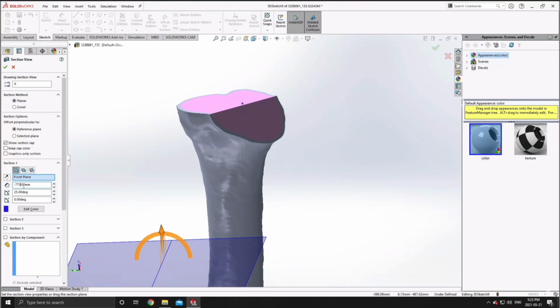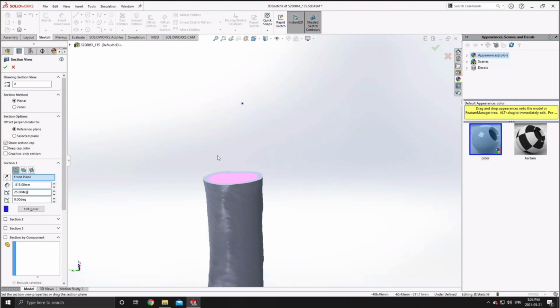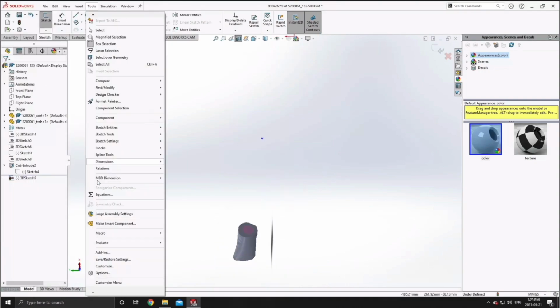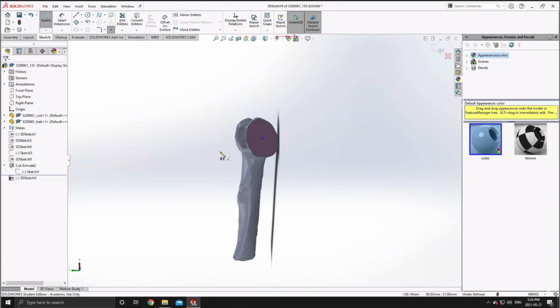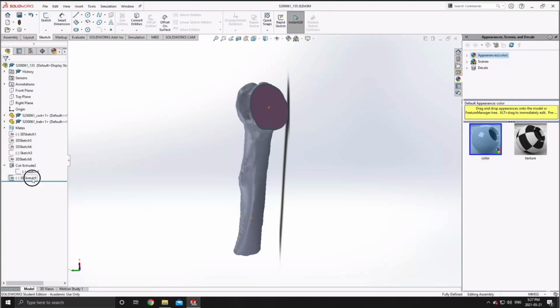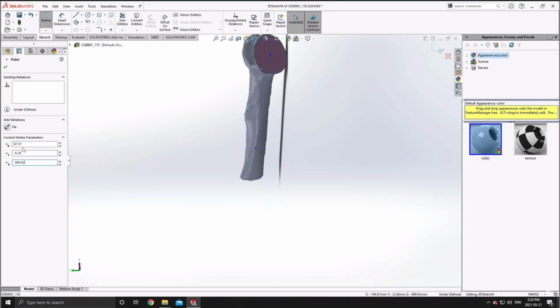distally in order to create another point which I'll use in conjunction with the central axis of our humeral diaphysis to create another cut plane by which we can shorten the trabecular bone, and then that process is of course repeated for the cortical bone segment as well. Moving forward here, you're just going to have to forgive the pace at which this process proceeds, but if you'd like, you can just skip forward to the next section, which will be the implant positioning part of the tutorial.